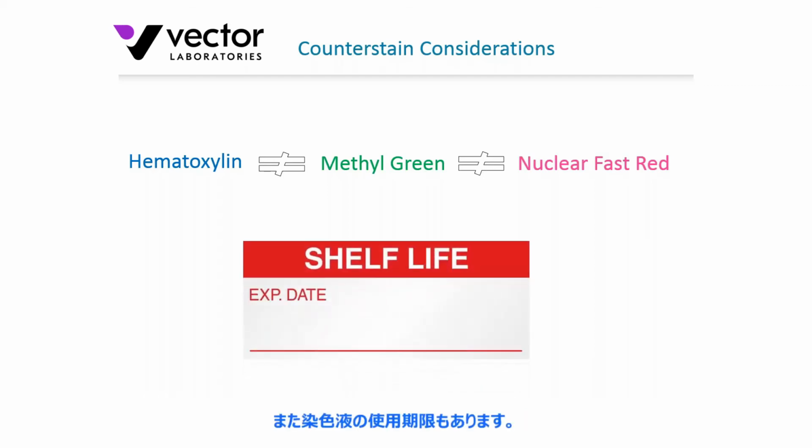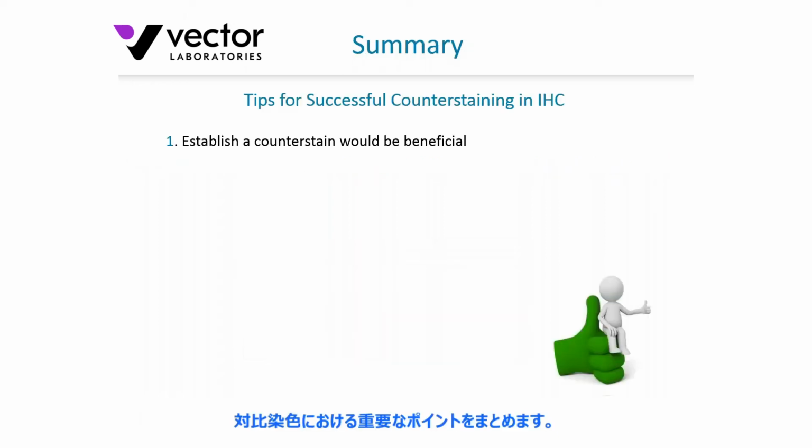Be aware of the fact too that these do have shelf lives. Methyl green, for example, should be a nice deep dark forest green color. If it has tinges of brown or rusty brown, certainly it has expired, so you will have to get fresh material.